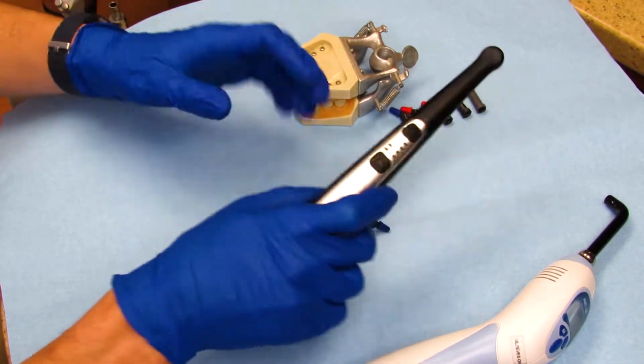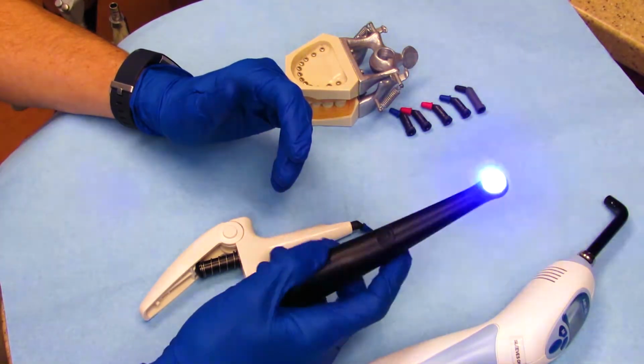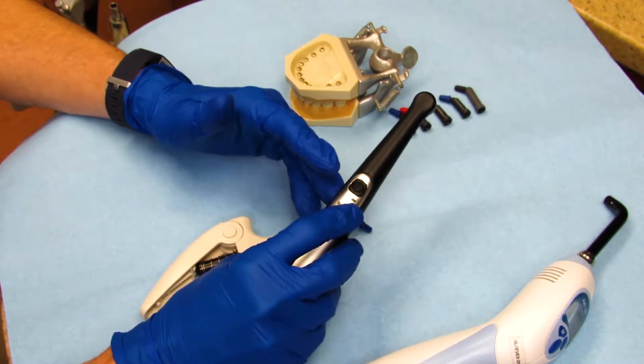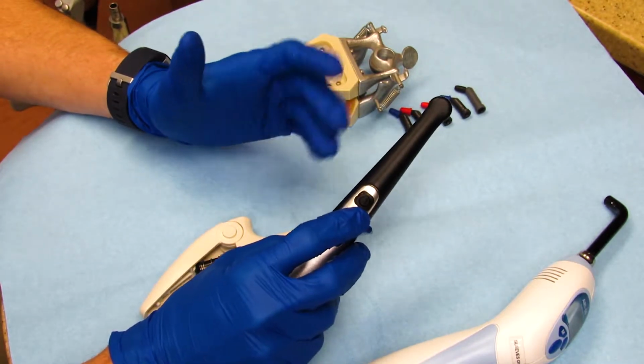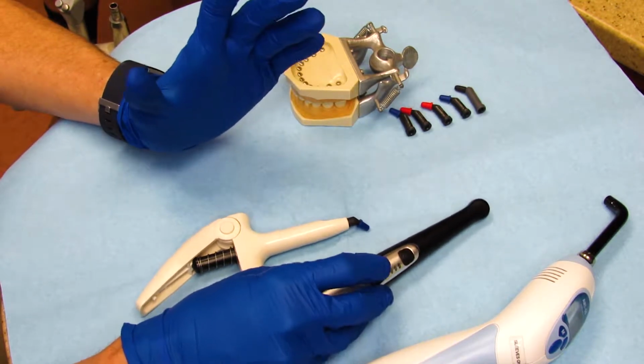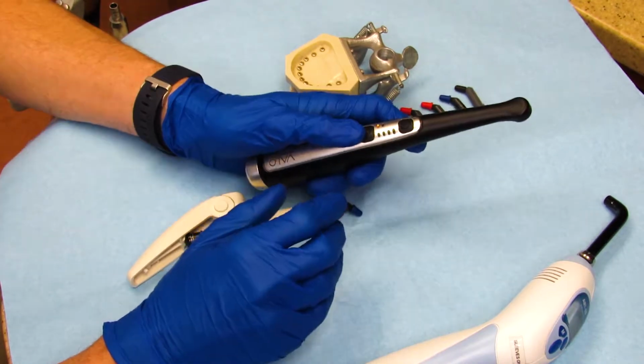Curing lights use blue light energy to cure or set up fillings and cement. I would estimate that we use a curing light 24 to 40 times a day. If it weren't for curing lights, there would be no tooth-colored fillings in dentistry, and all the fillings would be dark silver fillings. There's a bunch of different curing lights.